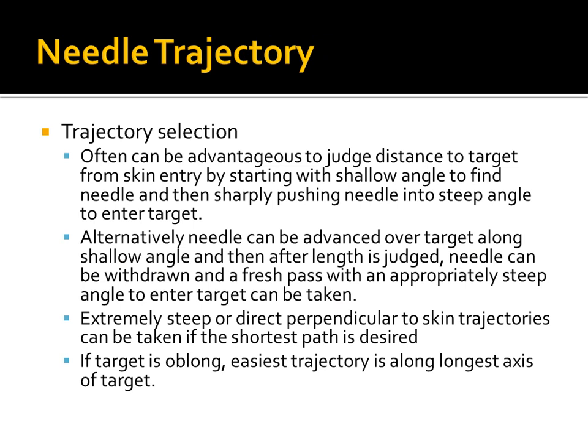For trajectory selection, it can be advantageous to judge the distance to the target from the skin by starting with a shallow angle. You start very shallow, push the needle close to the skin, and end up with a picture where your needle tip is on top of the object you want to enter — but you can see your needle very easily. Then you know your needle is perhaps one or two centimeters above your target. In one motion, you pull the needle all the way back, adjust your angle exactly as needed, and shove it all the way forward into the target without waving the needle side to side.